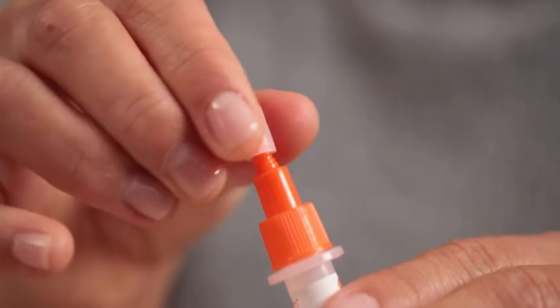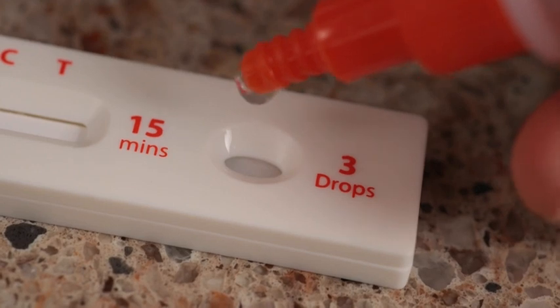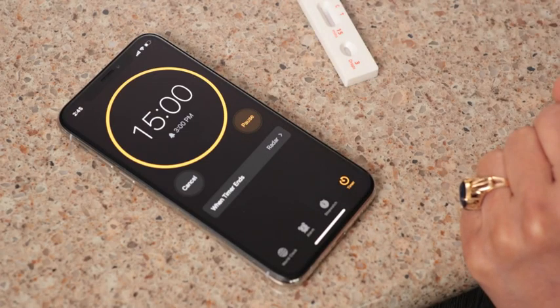You grew so close in such a short amount of time. Now let's test the sample. Remove the small dropper lid at the tip of your test tube and carefully squeeze three drops of solution into the receiving port on the test card.